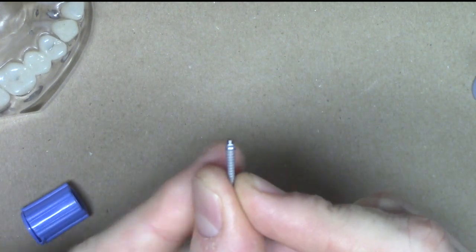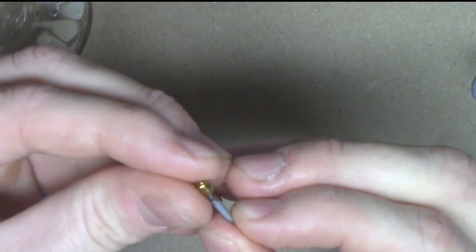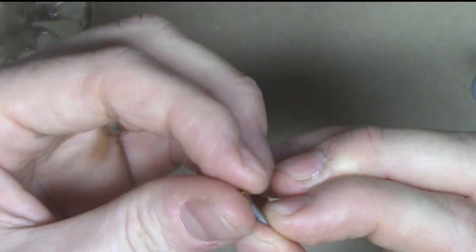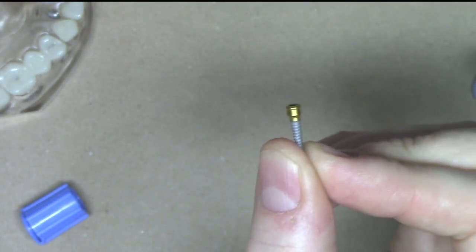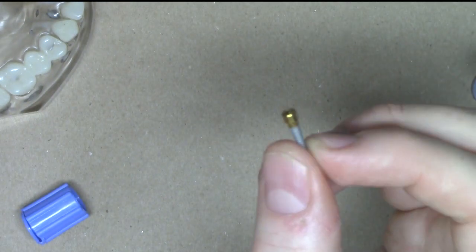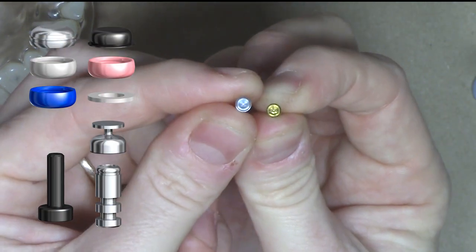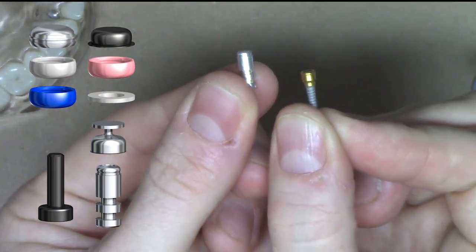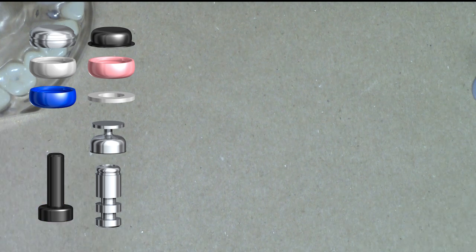Once we get to the prosthetic part, however, once you actually connect the abutment on the top, which in the LODI case, the locator overdenture implant system, is the locator abutment, I use all my standard locator overdenture parts, and I can make transfer impressions and impression posts using all the variety of different systems to get to this analog. In many ways, the same way that you would do with a standard diameter implant.